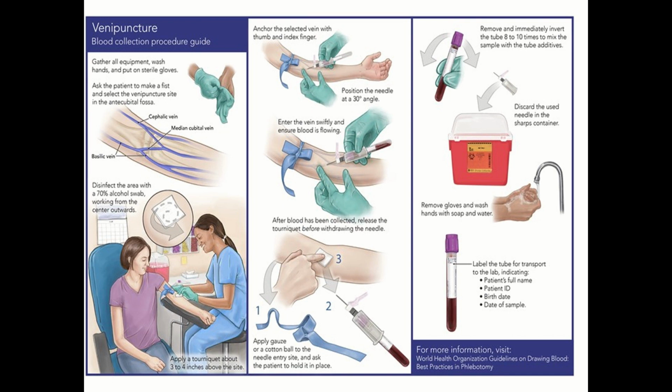Later you apply it, like after you have disinfected the area, you apply a tourniquet about 3 to 4 inches above the site. Now here I want to mention something really important. You cannot leave the tourniquet for more than 1 minute because it causes hemoconcentration. And what hemoconcentration does, it alters the results of your investigations. Your blood sugar levels will be altered, your cholesterol levels will be altered. So they're going to give you wrong results. So you need to make sure that you do not leave the tourniquet for more than a minute to avoid hemoconcentration.